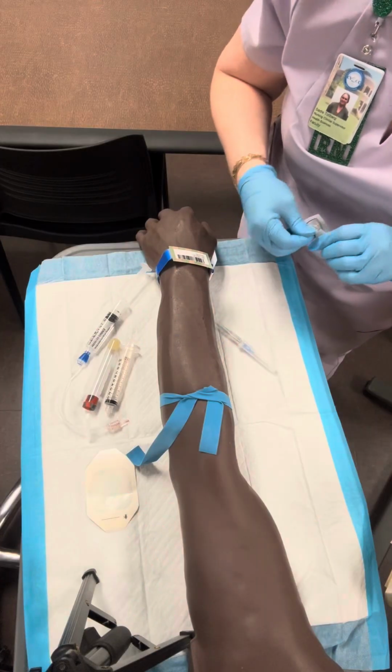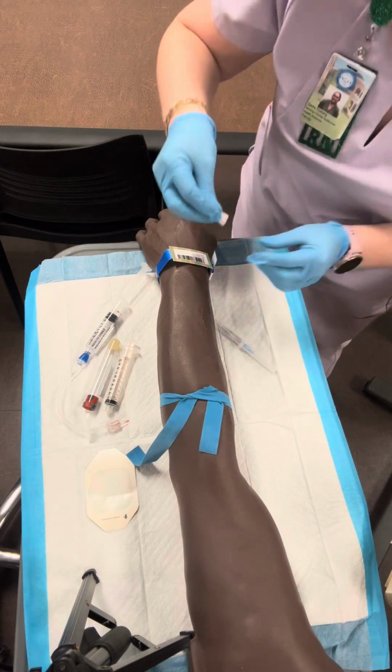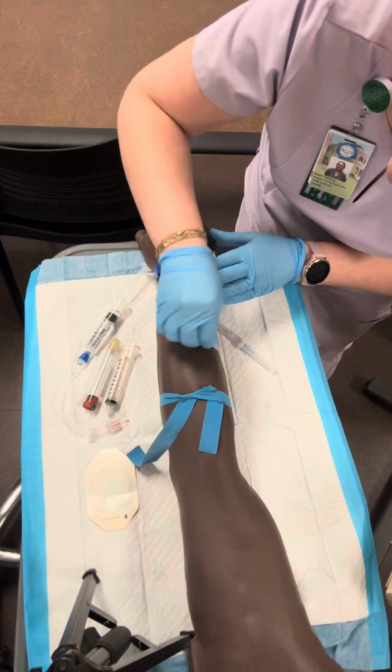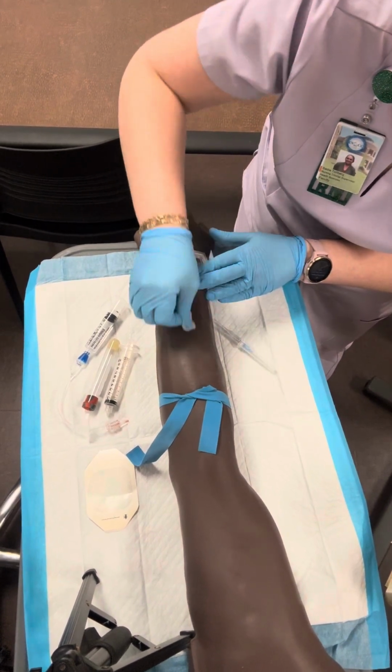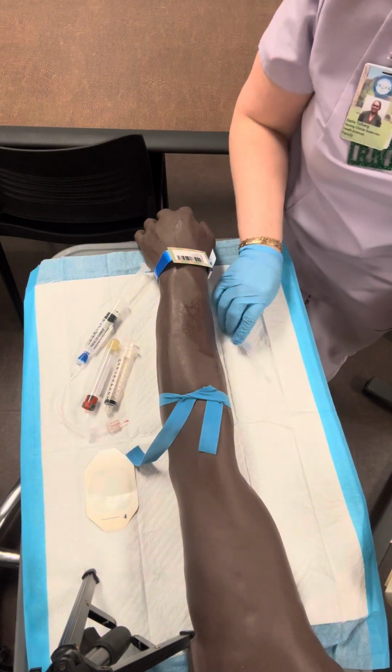Okay, I have my tourniquet on. I'm going to clean the site here. I'm going to go from the inside out. And that will take about 30 seconds to dry.